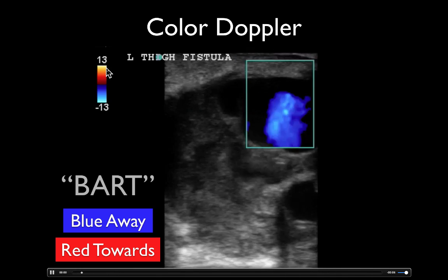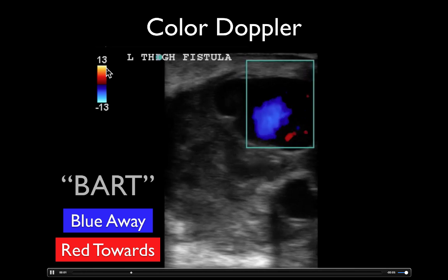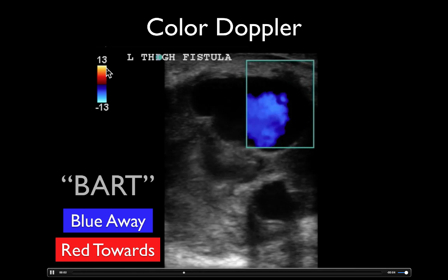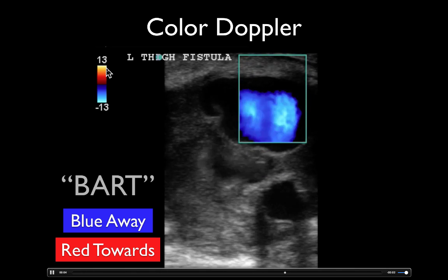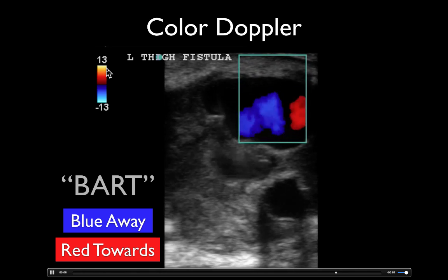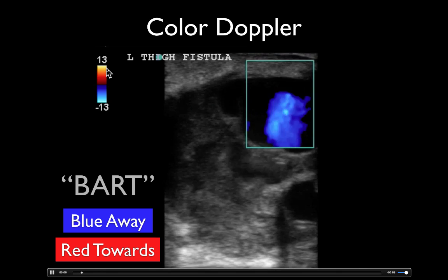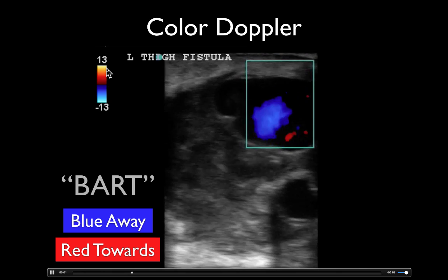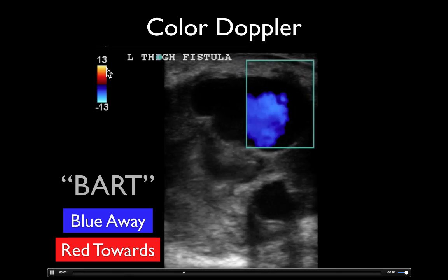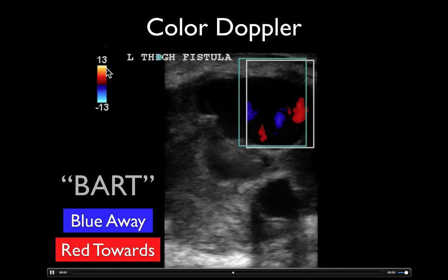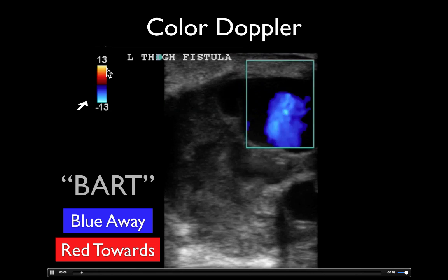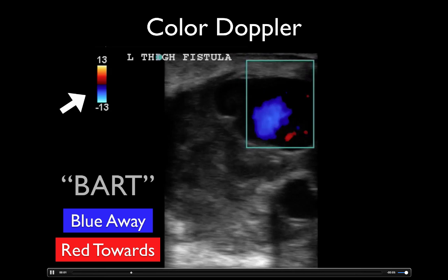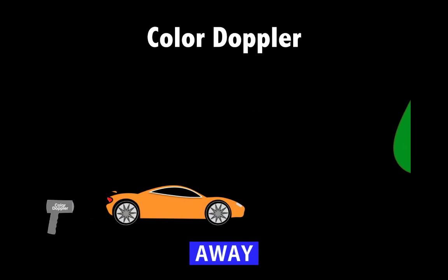This is a little confusing here — we see both blue and red, and that's because this is a pseudoaneurysm. Essentially, that blood is cycling around and around within this structure.